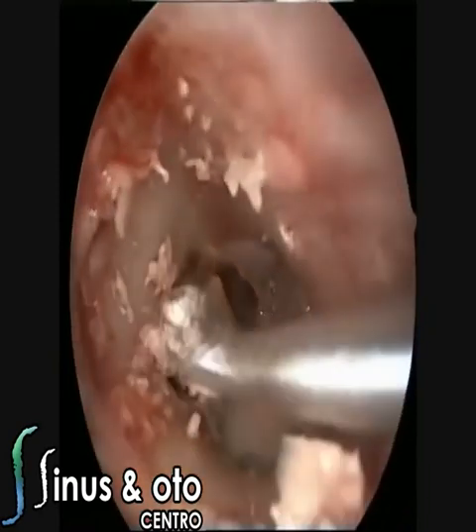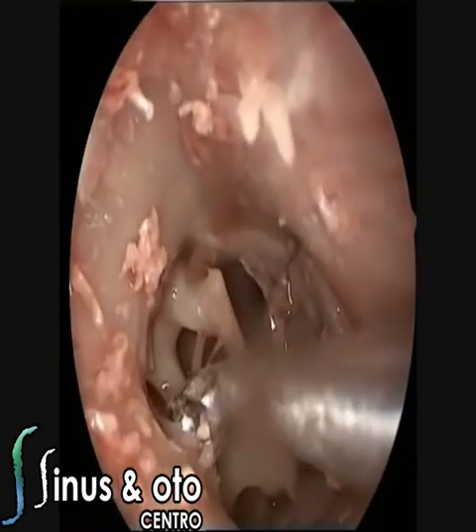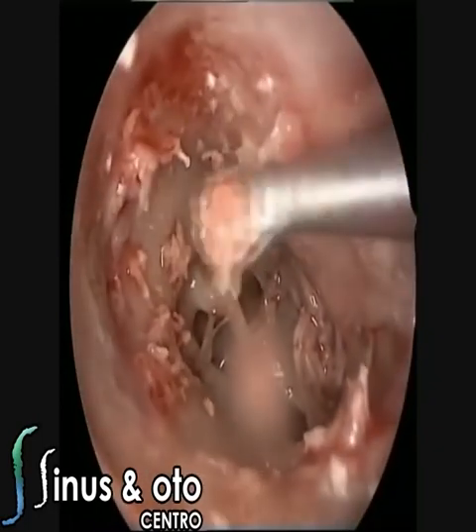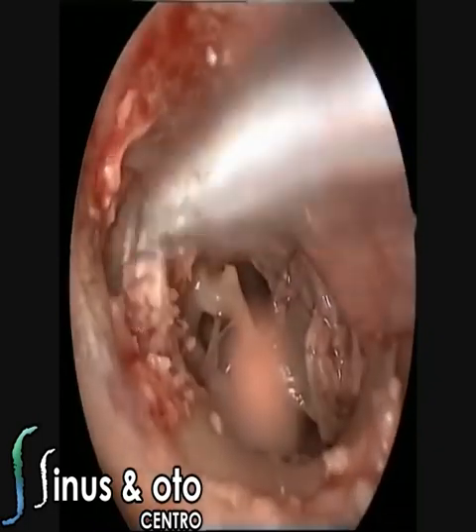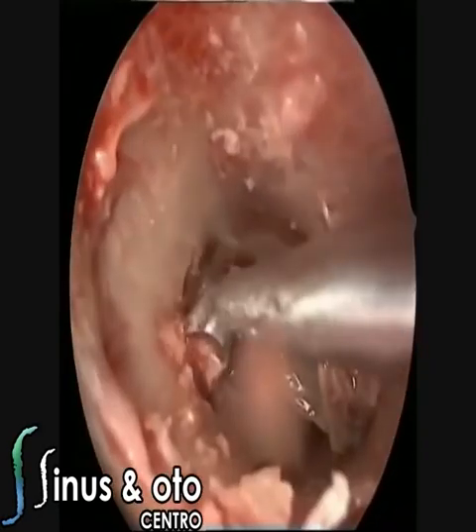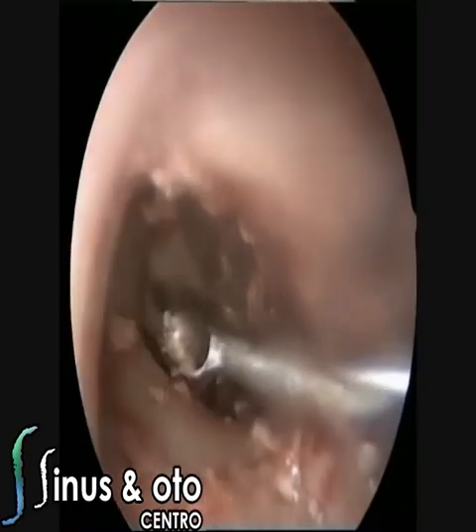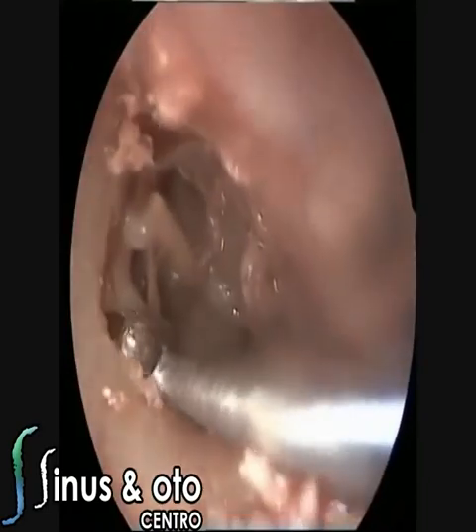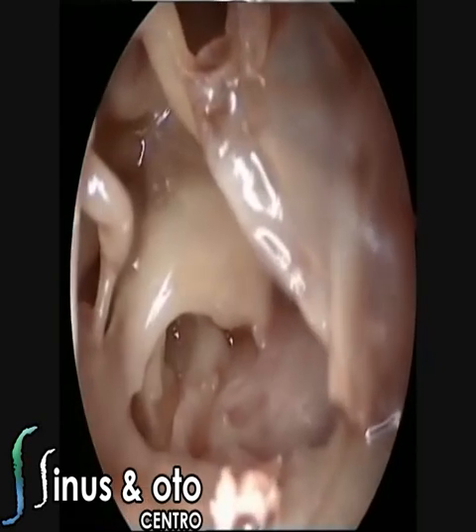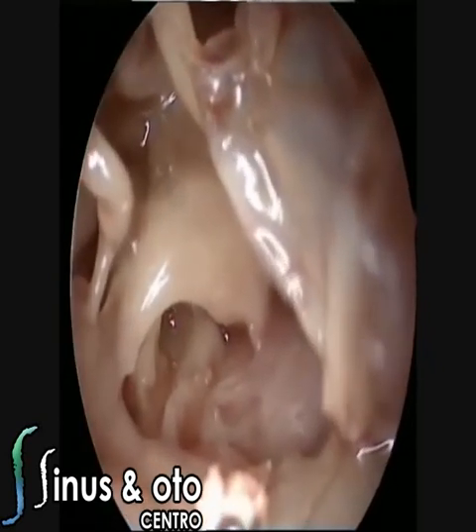In some cases there are sinus tympani that are very deep behind the facial nerve, so you cannot see it in a very good way using only the microscope as the main tool for the surgery. So the endoscope is a very nice tool to try to understand this anatomy and to see the anatomy that is hidden when you have a microscopic only approach.